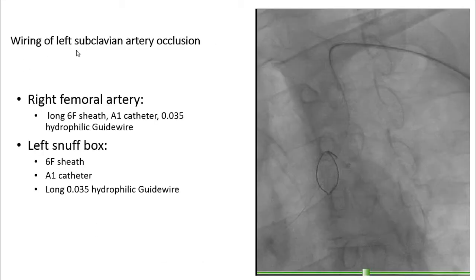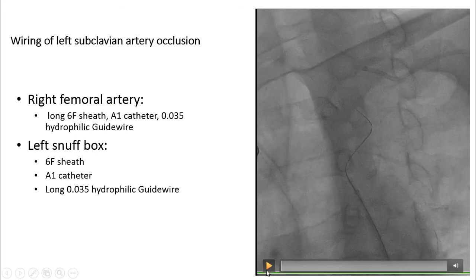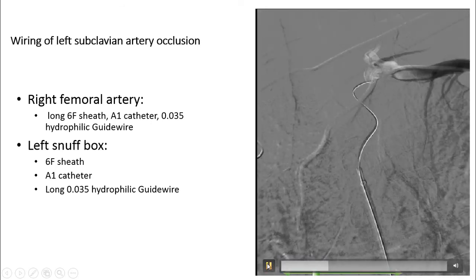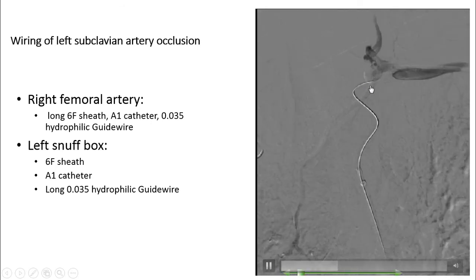Wiring of the left subclavian artery occlusion was first attempted from the right femoral artery. We used a long 6 French sheath, an AL1 catheter, and a 0.035 hydrophilic guidewire. You can see our sheath, AL1 catheter, and hydrophilic guidewire — however, this was unsuccessful, as we could not re-enter the true lumen.